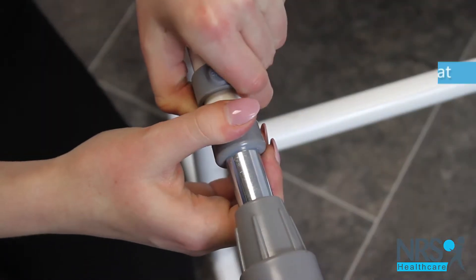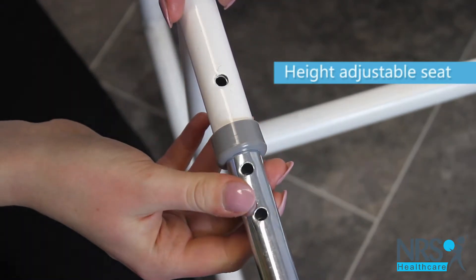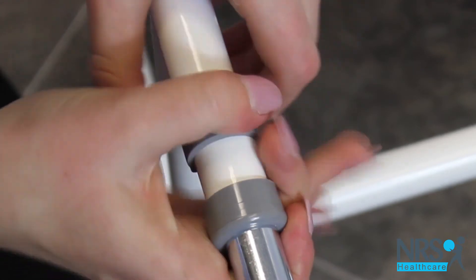It's height adjustable. Simply adjust the leg height by taking out the clips, sliding the legs to the appropriate hole height, and fixing the clips back in.